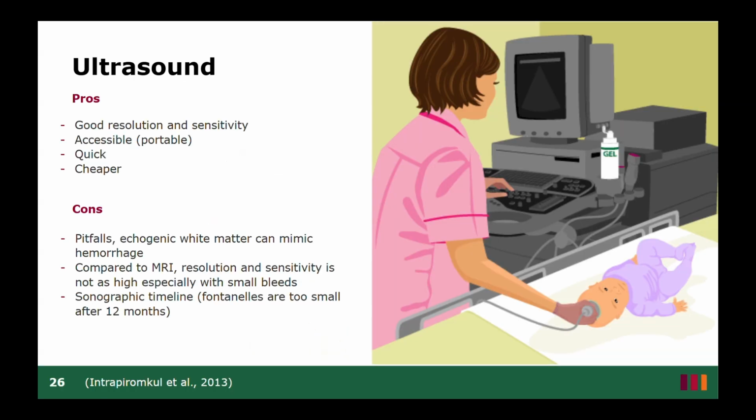Ultrasound stands out in terms of accessibility. We do portables and come to high-risk patients without disturbing them from their environment. Our scans are cost-effective and quick. For neonates, we use high-resolution, small-footprint transducers to provide detailed resolution.